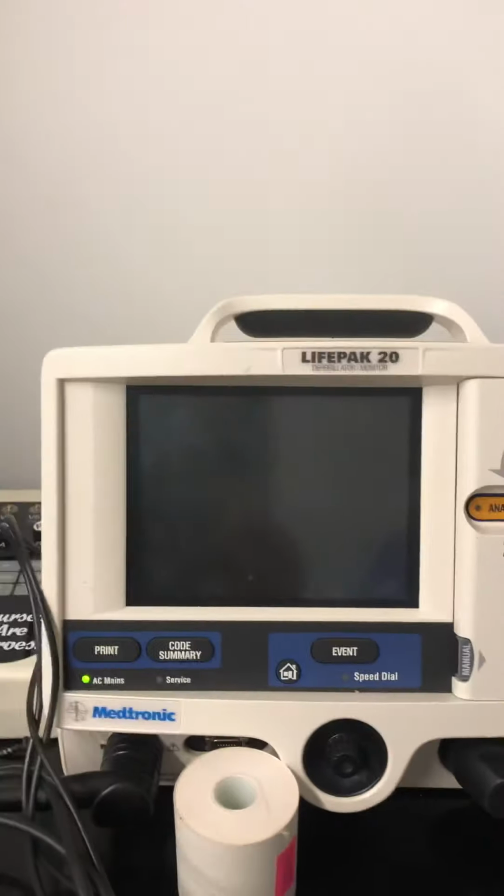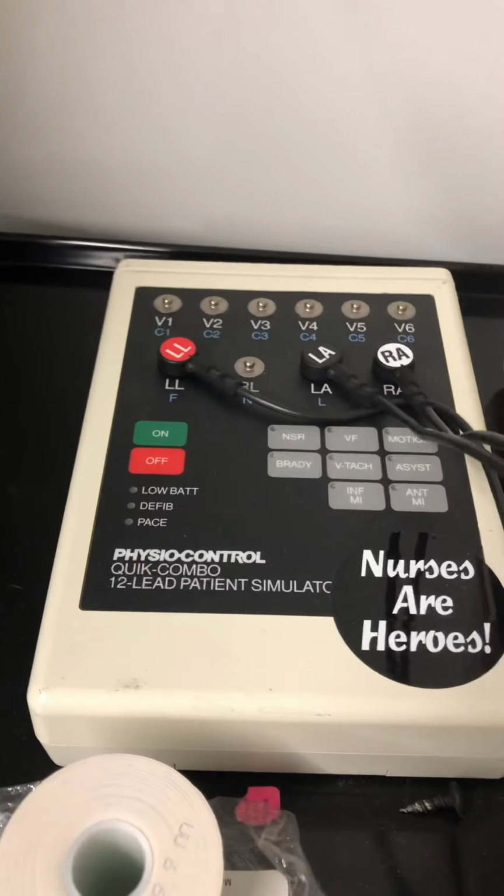Okay. These are the pads you've maybe seen on TV where they're going to shock someone whose heart is stopped, and so they can put both of the pads on, and remember they'll tell everybody to clear away because they don't want you to get shocked when you're touching the patient, and then you would administer a shock that could hopefully restart the patient's heart. We can simulate lots of different kinds of heart rhythms with this equipment.